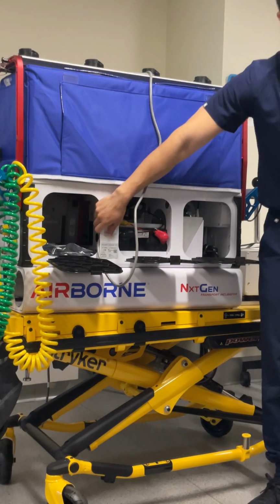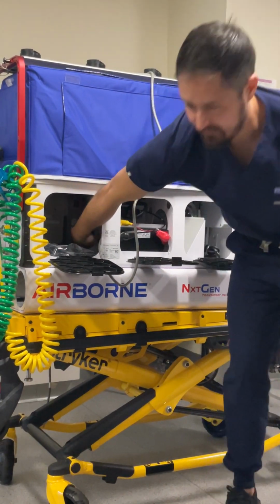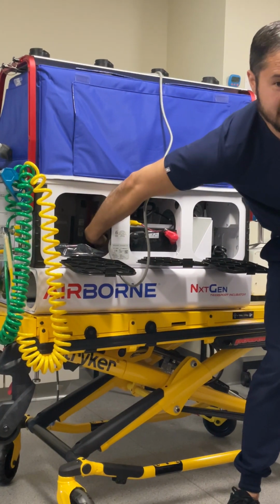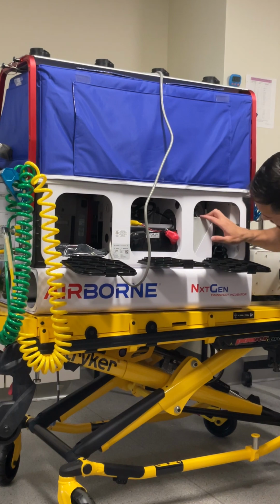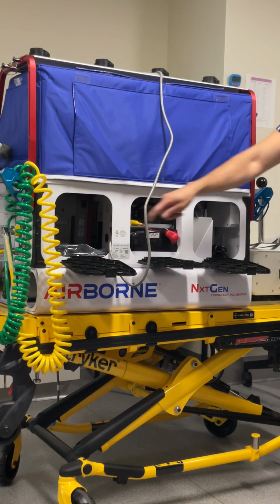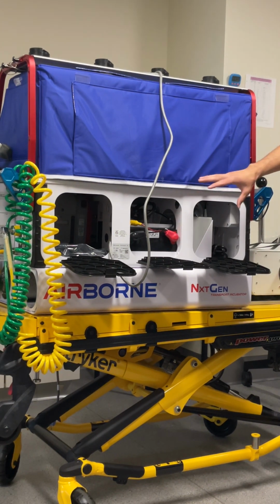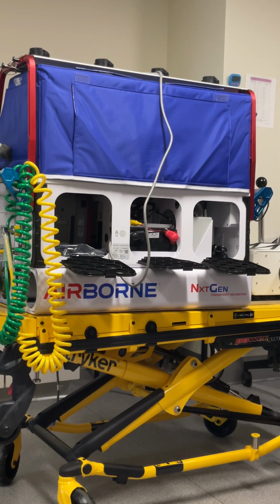One of the things that is important is that there are power outlets. You probably all can't see it, but they're right where my hand is. There's 3 available on this side. And then on this side, there's an additional 3, but it's behind the suction. The idea is that you're basically plugging in these black cables and probably never taking them out again. So there's 6 free power outlets versus what was originally usually only like 2 or 3 in the back of the Voyager. So a lot more power options.